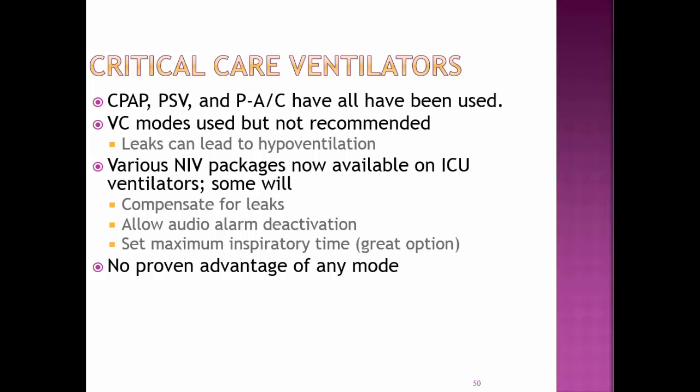Volume control is used but not recommended because the leaks lead to hypoventilation. Various NIV packages are now available on ICU ventilators. Some will compensate for the leaks, allow for audio alarm deactivation, and set maximum inspiratory time, which again helps out if you have a leak.